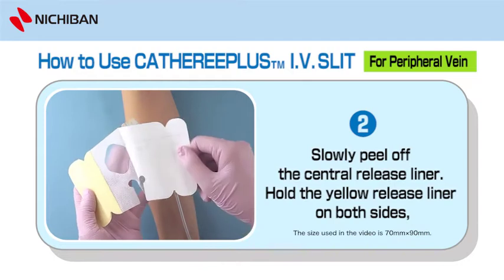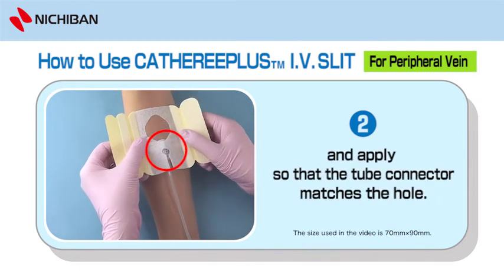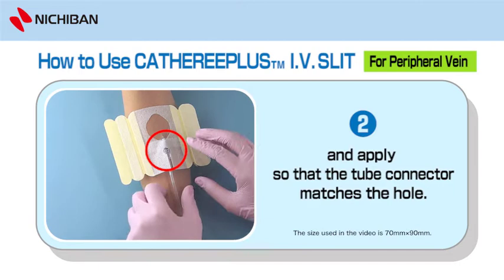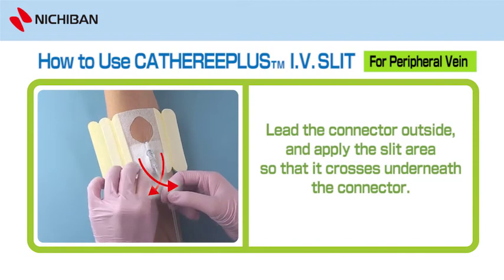Step 2: Slowly peel off the central release liner. Hold the yellow release liner on both sides and apply so that the tube connector matches the hole. Leave the connector outside and apply the slit area so that it crosses underneath the connector.